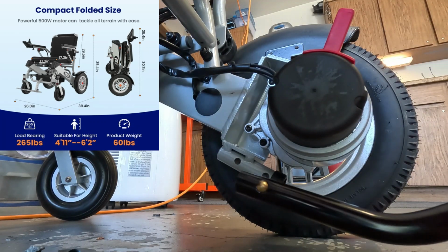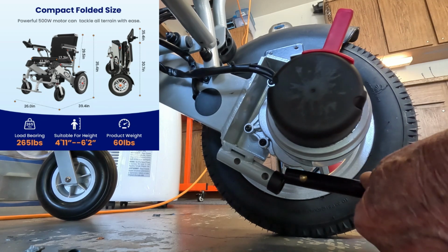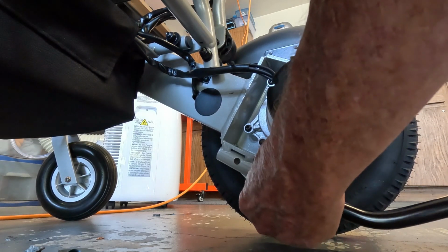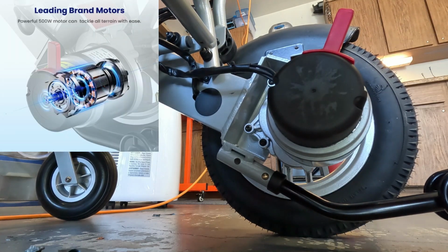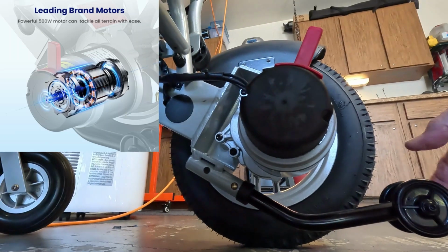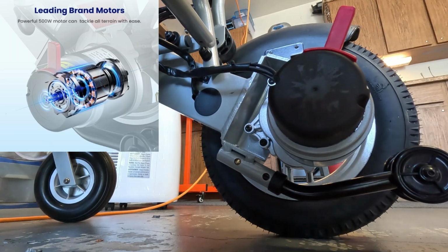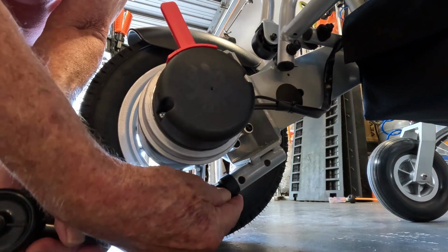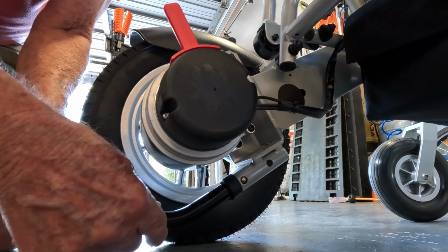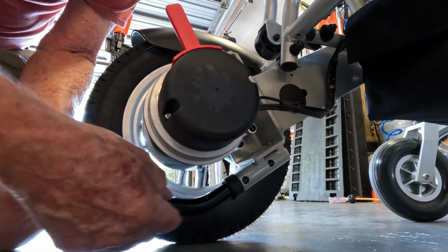All right, there is a left and a right. The wheel is going to go out like this. It's going to go in here, and you have two holes there that you can work with. First hole, it sticks out farther right there, but I'm going to go on up to the next hole, and there's where that'll go. And then we'll put this one in the other location, and you can't put them in wrong because the little catch ball won't snap in if you get them on the wrong side. There.